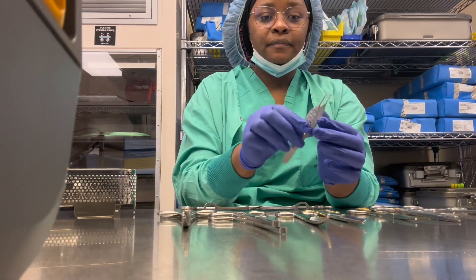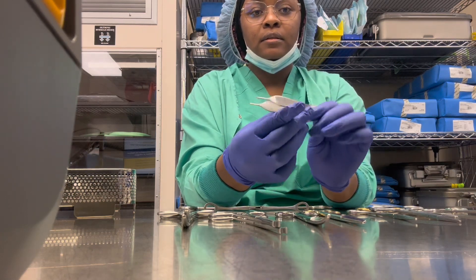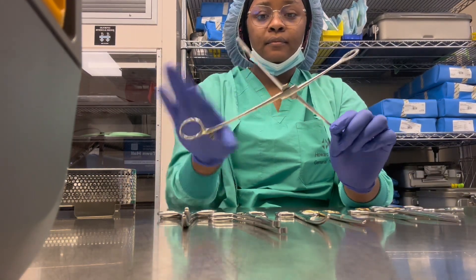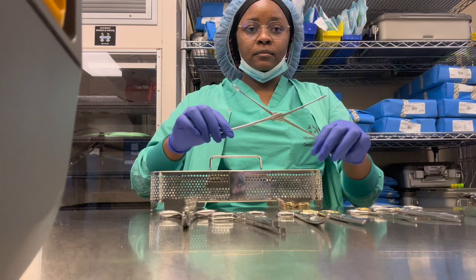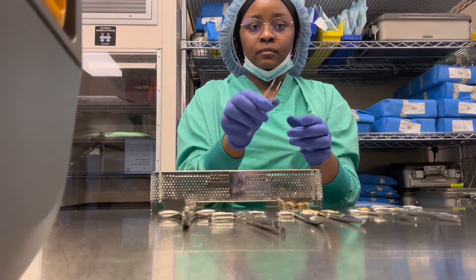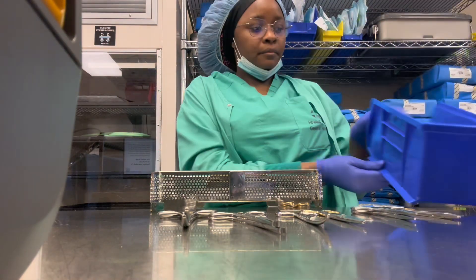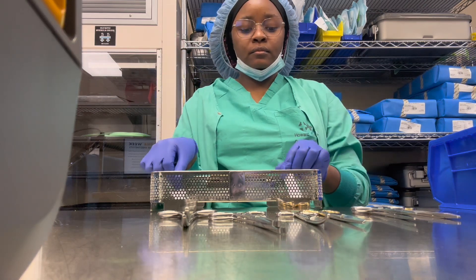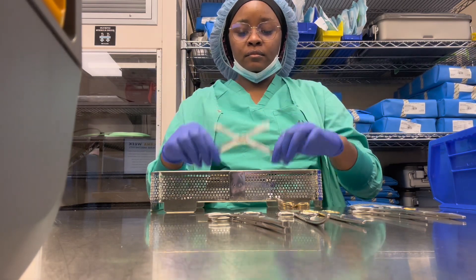This right here is a forcep — it's useful for grabbing. And this is my sponge stick. Now I'm going to go ahead and set up my set. Remember, before you set up a set you always have to put in the indicators, because if you don't put in the indicators the set is not sterile and cannot be used. So I'm arranging my instruments nicely and putting them in.